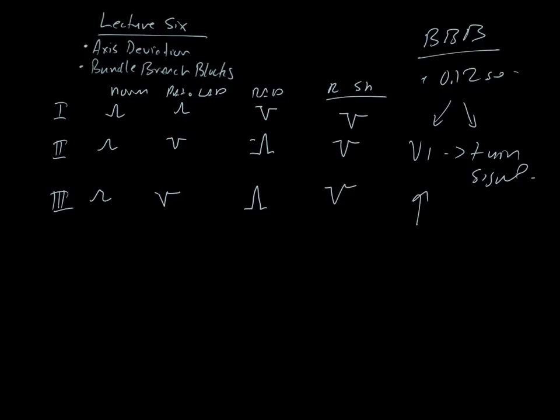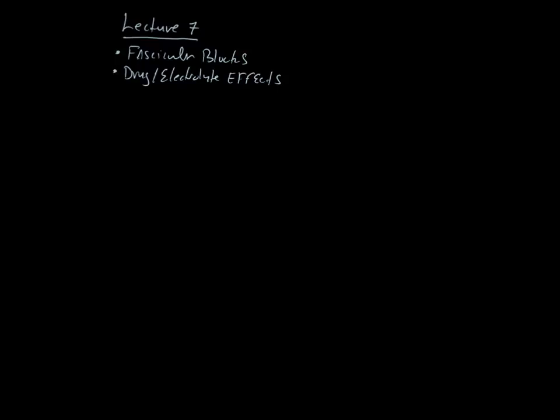If it turn signals up, that is right bundle branch. If it turn signals down, that is left bundle branch block. Good deal. Guys okay with that? Cool. Okay, fascicular blocks, drug electrolyte effects.